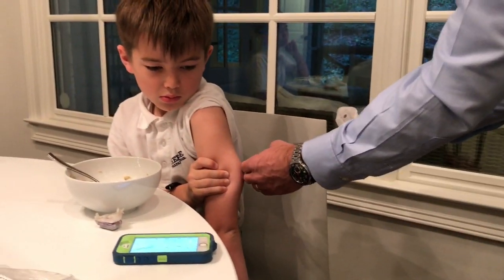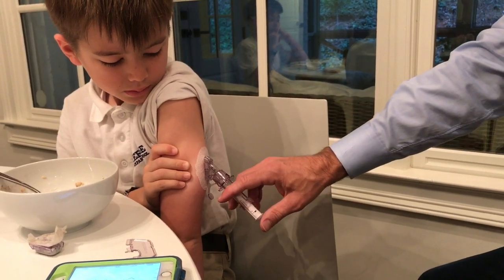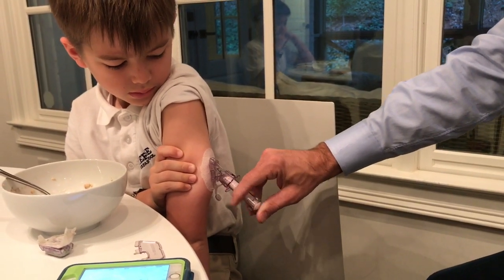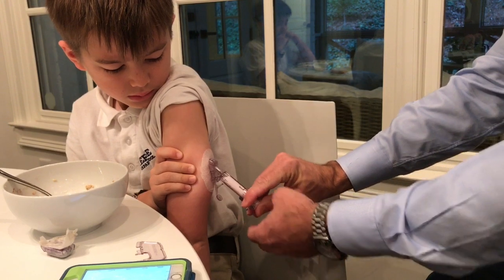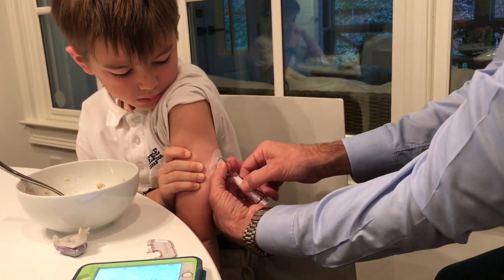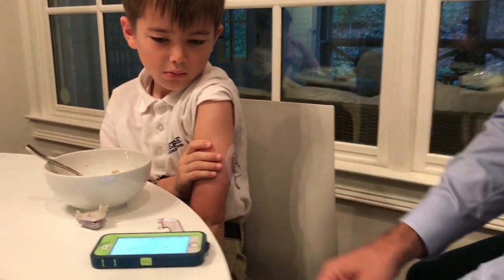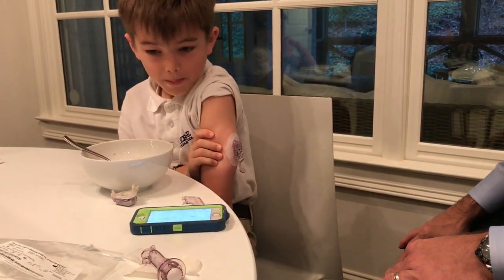Bradley has it on his arm and he's ready for the insertion. This piece pushes it in, this piece allows us to take it out, and then you just pinch this and it'll come off. And now we are ready.